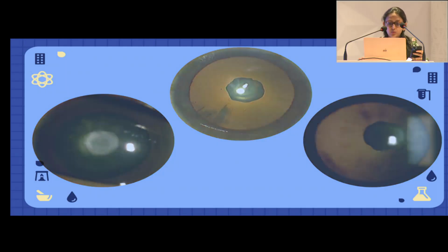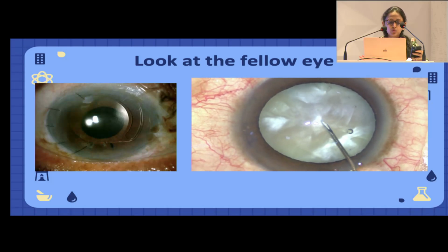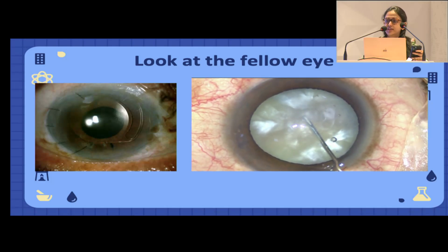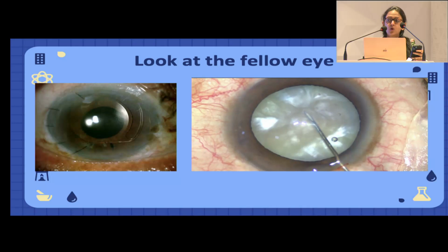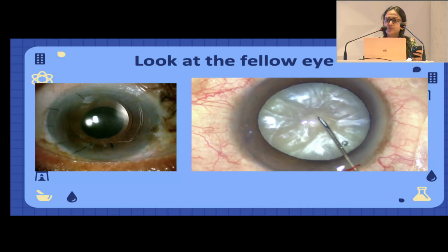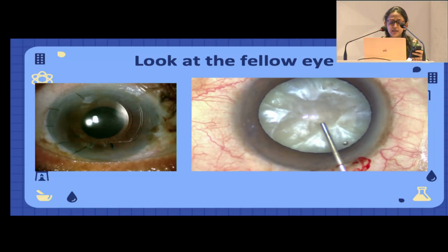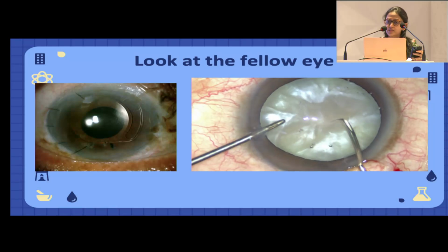If there is a total white cataract in one eye, the fellow eye can give the surgeon a clue about what has gone on in the eye. For example, the presence of an ACIOL or another polar opacity in the fellow eye. So the surgeon knows to anticipate problems and start following the protocols of PPC in that case. A pre-op AS-OCT will also give an idea about the presence of PC dehiscence.